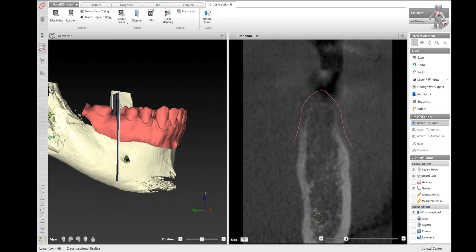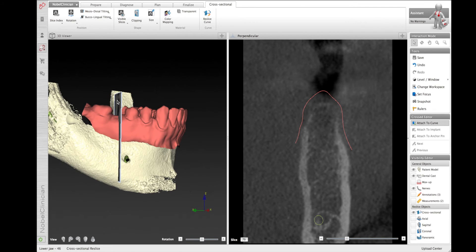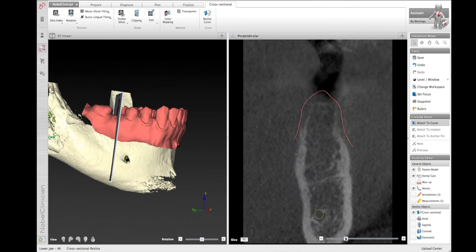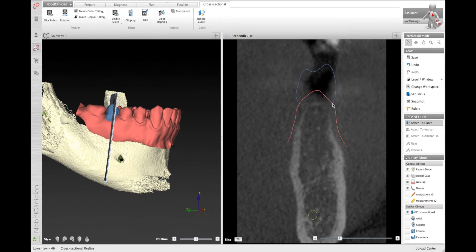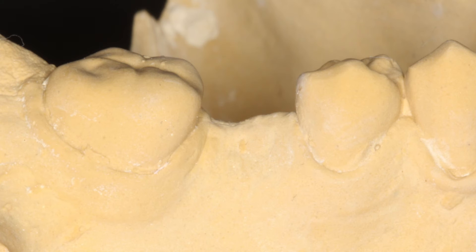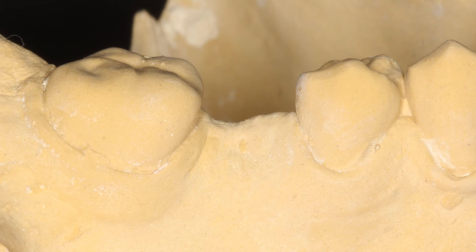Now that alignment has been confirmed, we can start to look at the site where we're going to place the implant. We can see the nerve is way down on this case, so it's one of those ideal cases we'd dream about. However, we do have to follow the angle of the bone. Looking at the cross-sectional window, the soft tissues come up quite a bit in the mid-crestal area. This mid-crestal area is a little high, and placing the implant here would give poor emergence profile and food entrapment around this site.